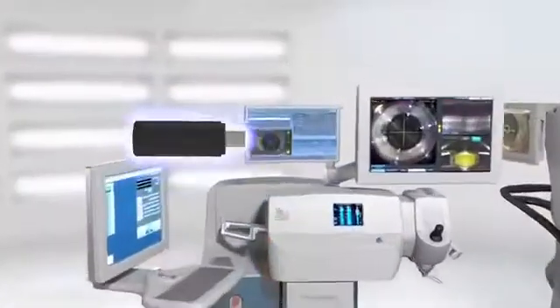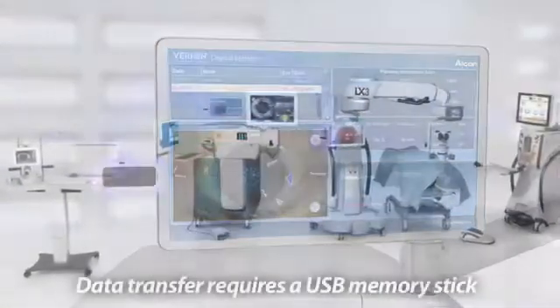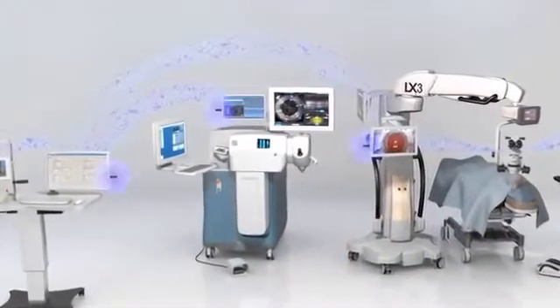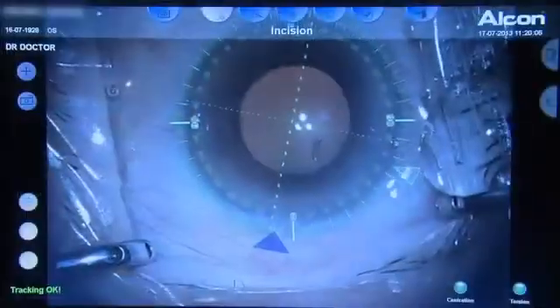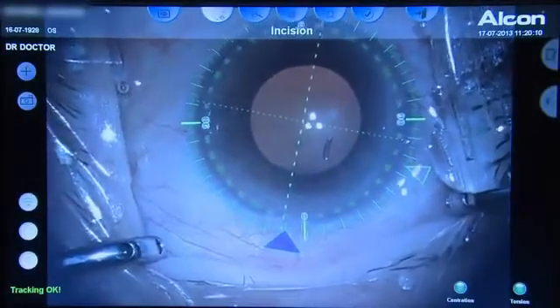The reference image and surgical plan are transferred from the Verion Reference Unit to the Verion Digital Marker via USB stick. During the execution phase of the procedure, using the reference image as a fingerprint, the Verion Digital Marker allows surgeons to position all incisions and alignment in real time while accounting for the variable impact of cyclo rotation.